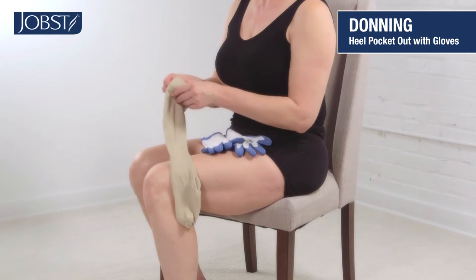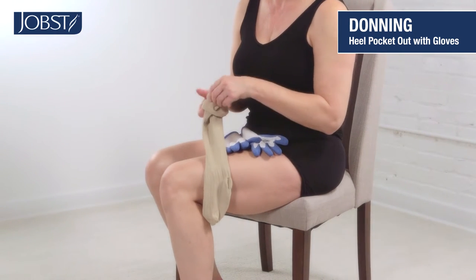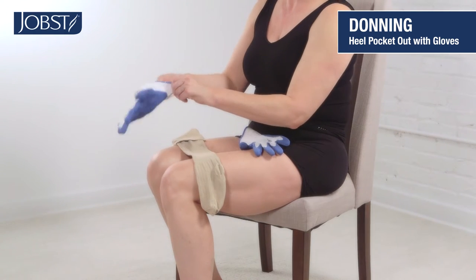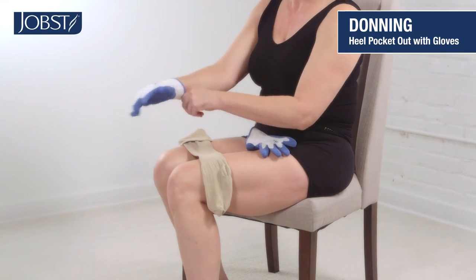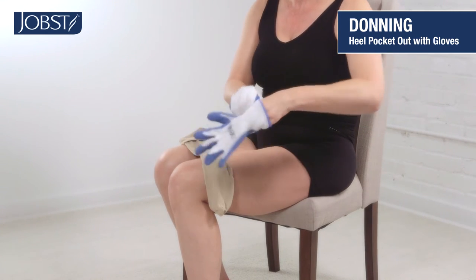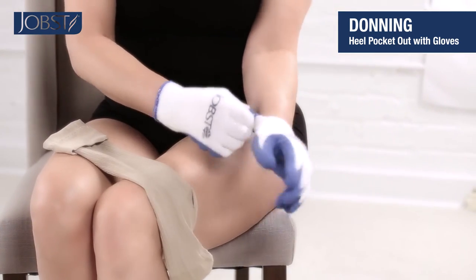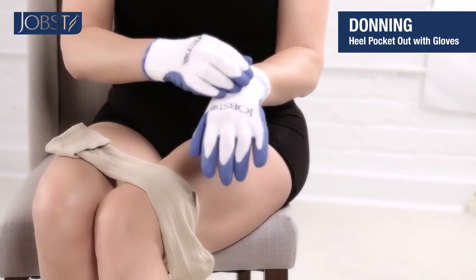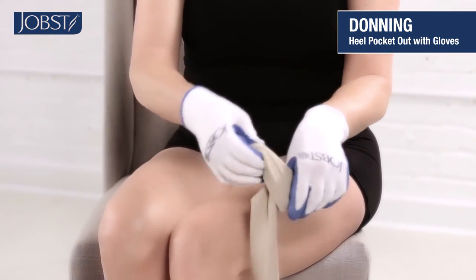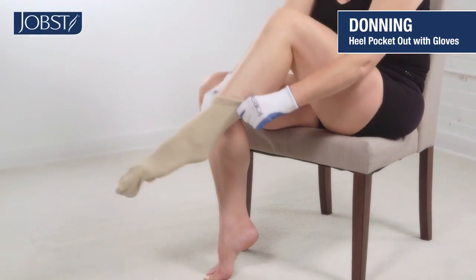First, prepare the stocking by folding the top over. Now put on your Jopst rubber gloves. Hold the flapped opening with both gloved hands and slide your foot in until your toe and heel are in place at the foot.